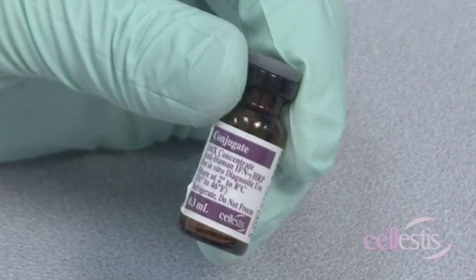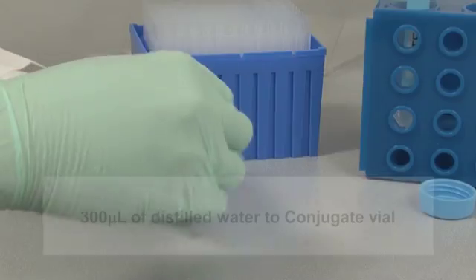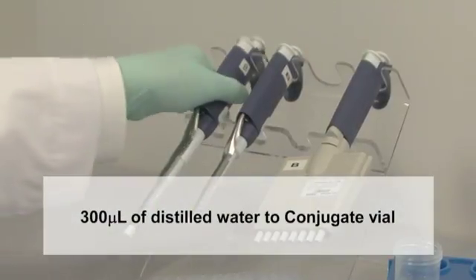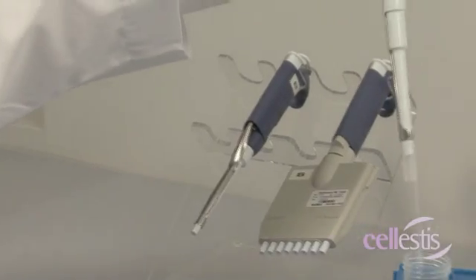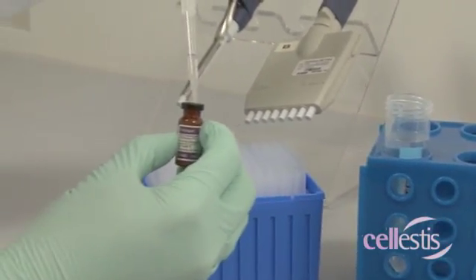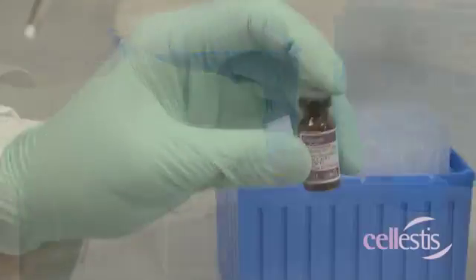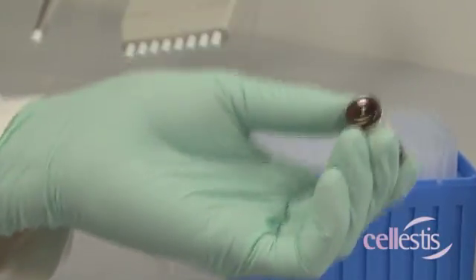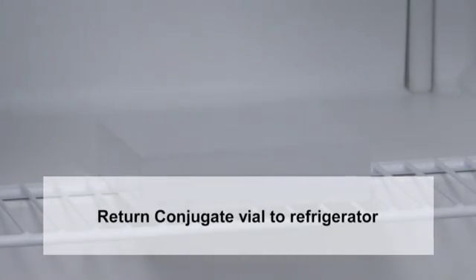For the conjugate, add 300 microlitres of distilled water to the vial and mix gently to avoid frothing. The conjugate vial should be immediately returned to the refrigerator.